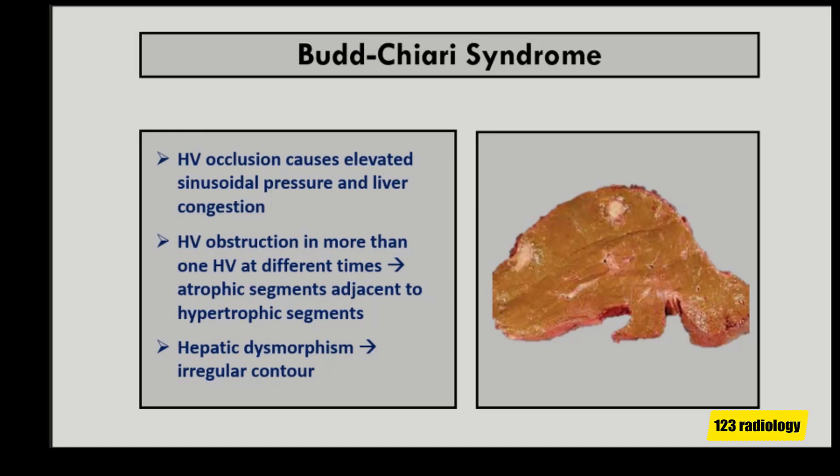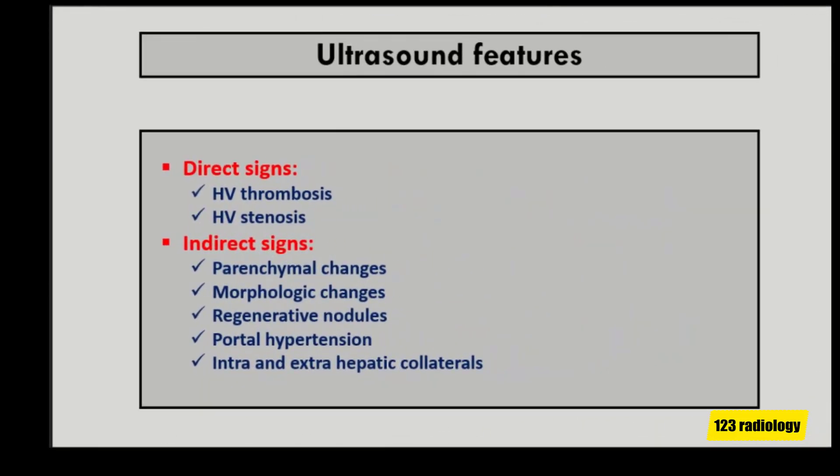The most characteristic feature of hepatic dysmorphism is irregular liver contour. Ultrasound features of Budd-Chiari syndrome are classified into direct signs, including hepatic vein thrombosis and hepatic vein stenosis, and indirect signs, including parenchymal changes, morphologic changes, regenerating nodules, portal hypertension, and intra- and extra-hepatic collaterals.